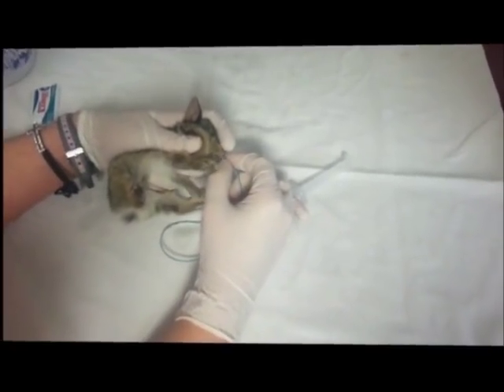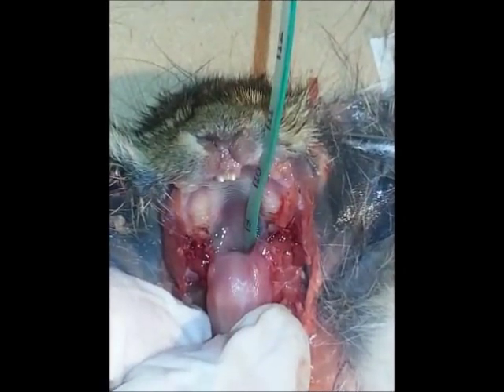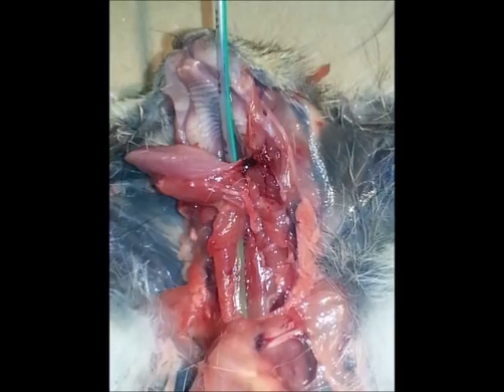Now, let's take a closer look into the cottontail's esophagus and trachea. As you can see by the placement of the tube into the esophagus, the positions of the trachea and esophagus are very close in relation. So if you aim to the left side of the cottontail's throat, you will be more likely to enter the esophagus and continue into the stomach rather than the trachea and enter the lungs, causing aspiration if you administer the formula.